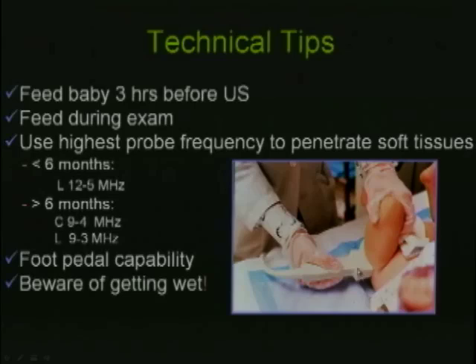It's probably the only time, at least for me, when I'll scan with my left hand, because I have to switch as I get to the right side of the baby, so I can scan with my left and maneuver with my right and not have to cross my hands one over the other. Do be careful of getting wet. Just open one side of the diaper at a time.